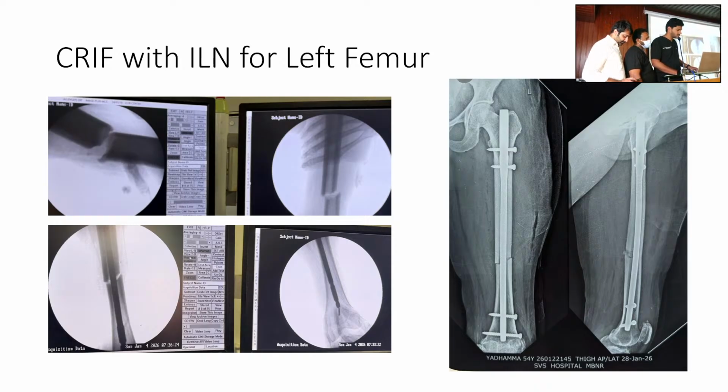How did you do it? Before applying the distal locking screws, what did you do? We pushed it from the knee towards the fracture. We released the traction and pushed it with the hand. Just by releasing the traction, it has gone.